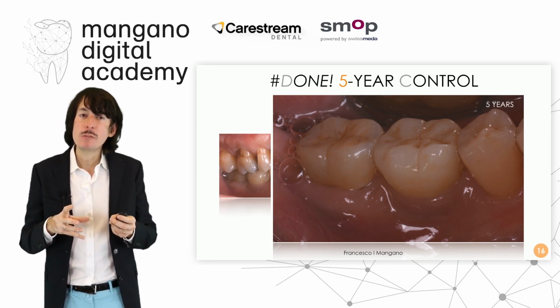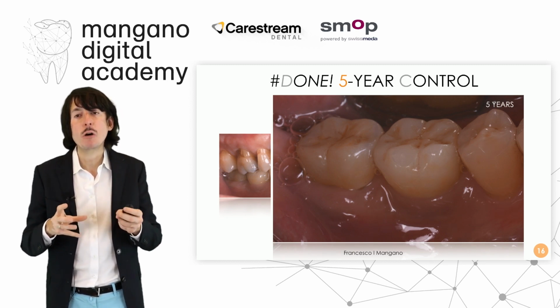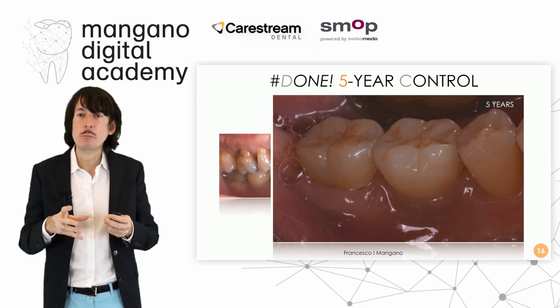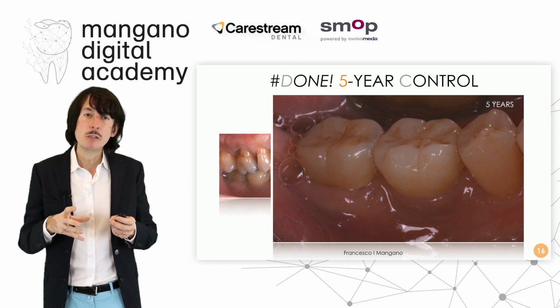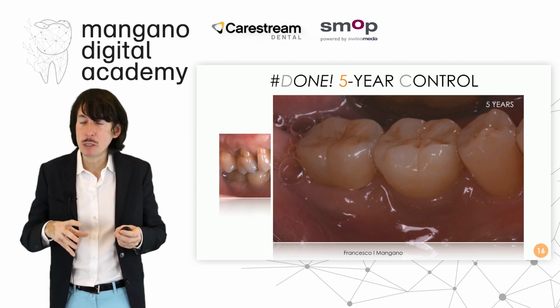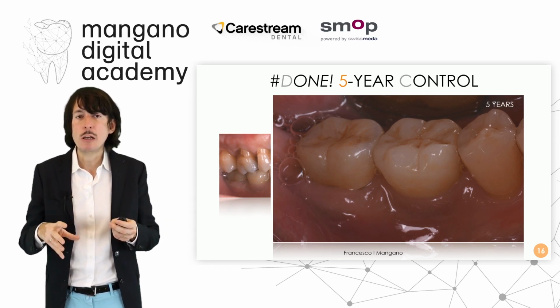And I prefer to have zirconia below, because the soft tissues love zirconia below, particularly if the collar is thick, the tissues are thick and the implant is very deep. It's very useful to have an individual hybrid abutment, because we have zirconia below, we have zirconia on the abutment, we have zirconia on the crown, and the soft tissue really loves zirconia.